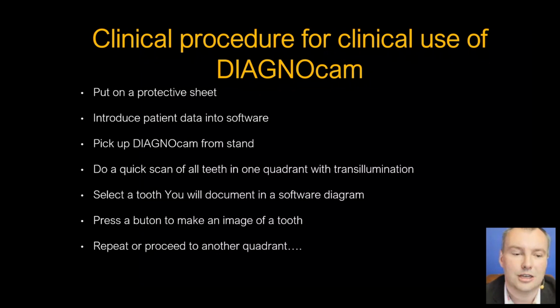So this is a whole summary of this part, the clinical procedure for clinical use of DiagnoCam. If at any time during the presentation you are taking some pictures, which I am happy for, because then I know it's useful for you, this is the good moment to take an image of that slide, because this is the whole clinical procedure for the perfect work with DiagnoCam. Okay, if you need it, we can come back to it at the end.